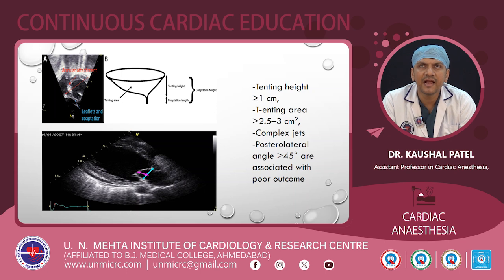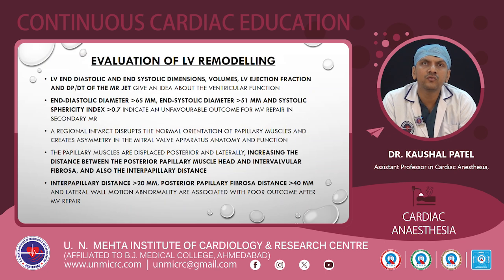If the tenting height is greater than 1 centimeter, the tenting area is greater than 2.5 to 3 square centimeters, there is a complex MR jet, and the posterolateral angle is greater than 45 degrees, these are associated with a poor outcome. So for that we do a mitral valve repair, followed by an assessment for the success of the repair. If the parameters are still not favorable, then we do mitral valve replacement for that patient.